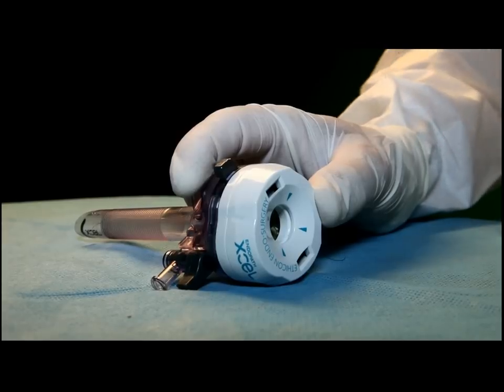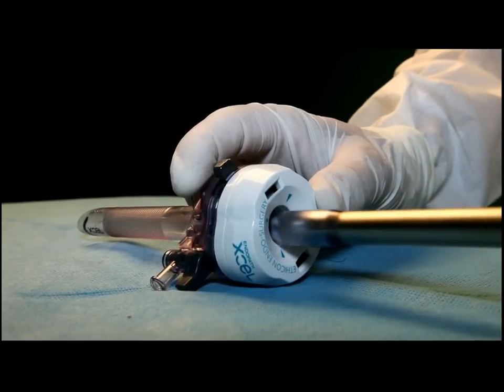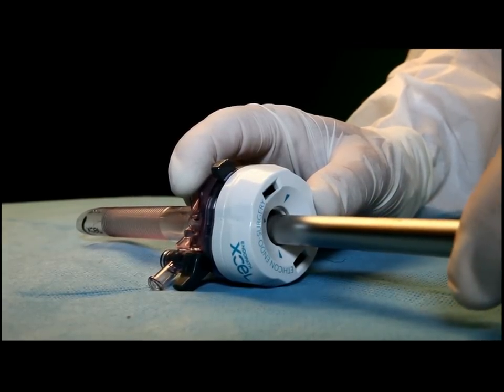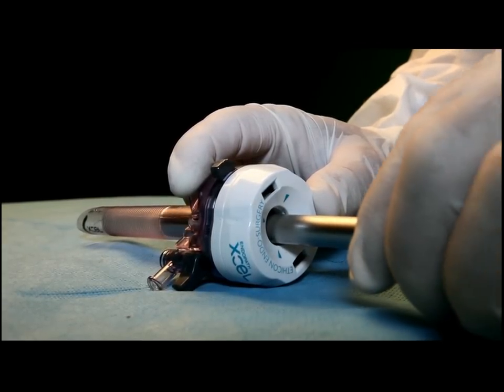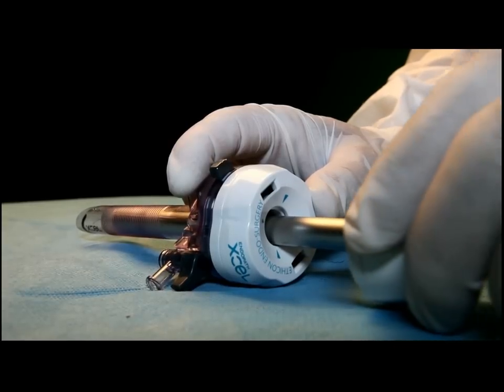Now you can insert the camera again, and the camera lens will stay clean while inserted into the port.